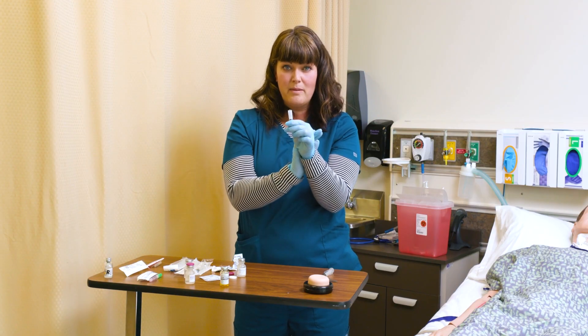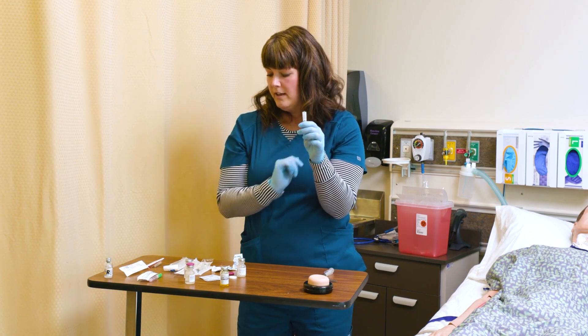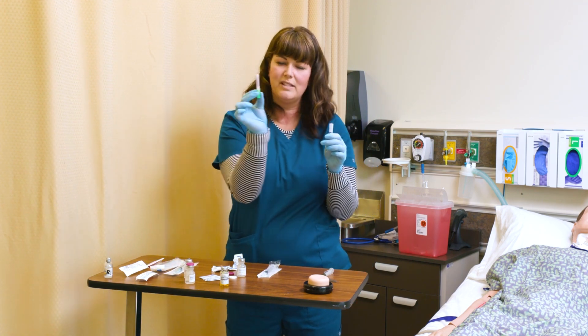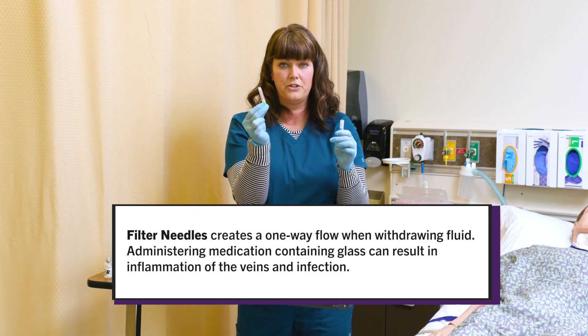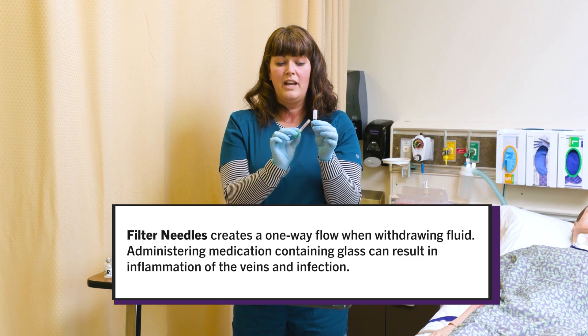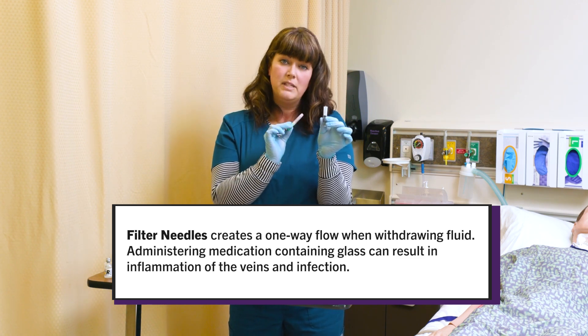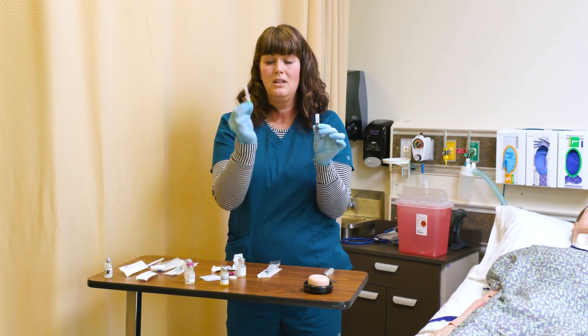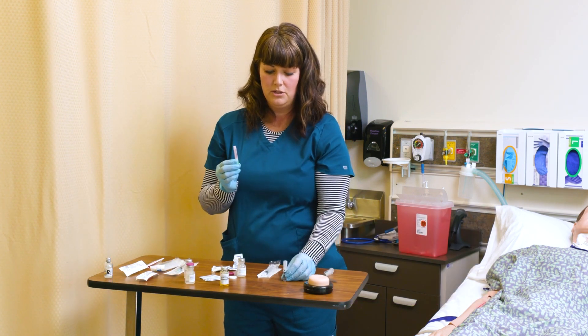I'm ready to break my ampoule, but I need one more thing. My syringe has to have a special needle attached — it's a filter needle. It actually contains a filter inside the needle. When I draw up this solution, there could be small glass particles inside it, and I don't want to inject that into my patient, so I have to use a special needle to draw that up.